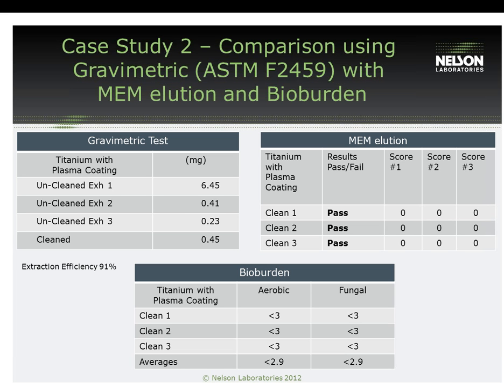And then pairing this test with MEM elution, they sent in 3 samples and received all scores of 0, which show no cell lysis. So they can also say with that 0.45 milligram residue that it's non-cytotoxic.